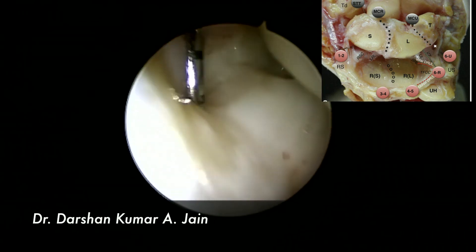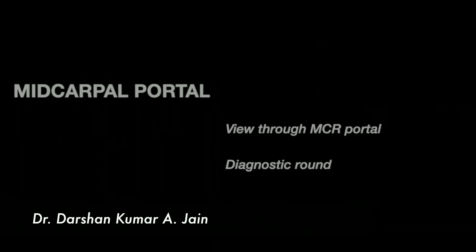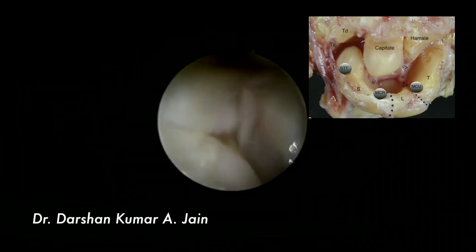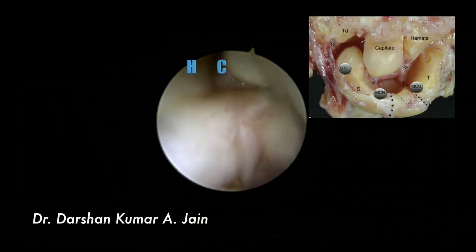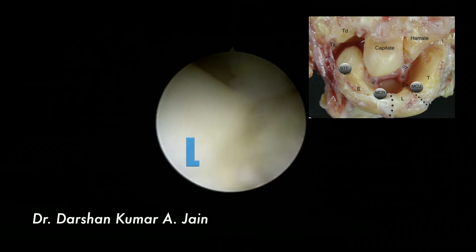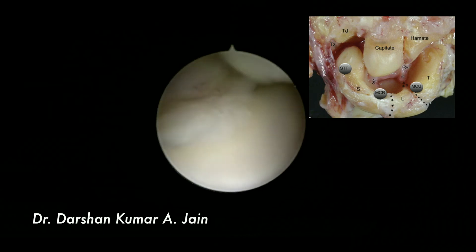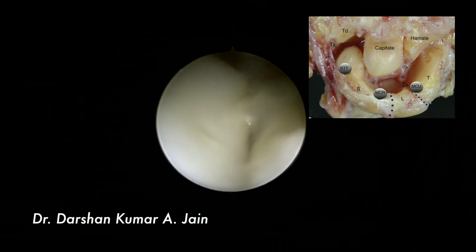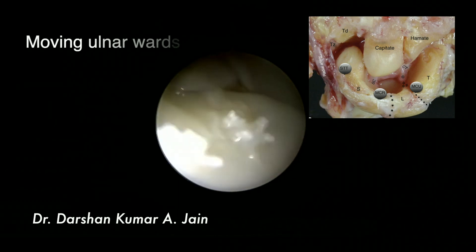Next will be the midcarpal portal, a view through the MCR portal. Once the scope is in the midcarpal portal, that's the hamate, capitate — then you get the orientation, you identify the lunate, the scaphoid-lunate interosseous ligament, the scaphoid, then moving ulnarwards, that's the LT interval.